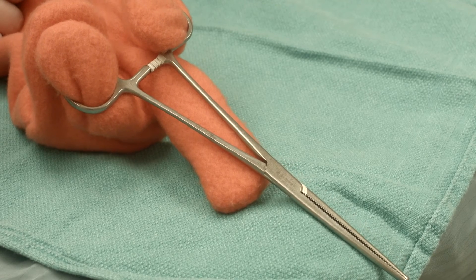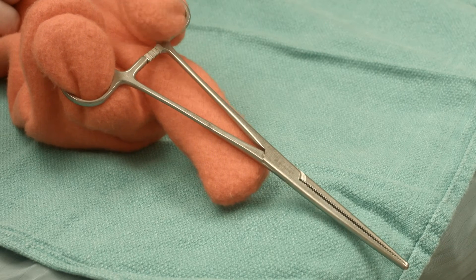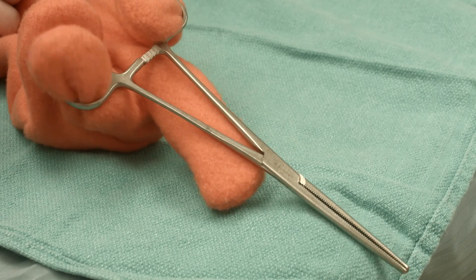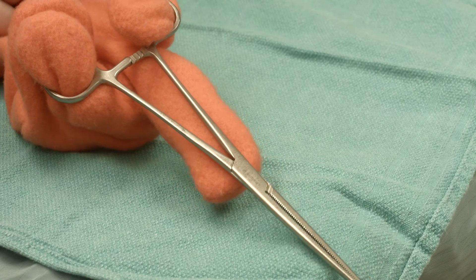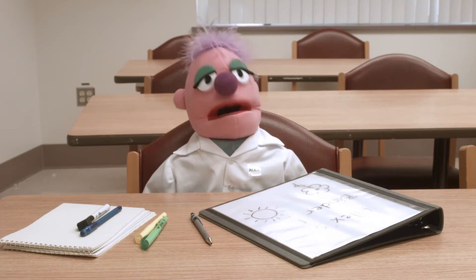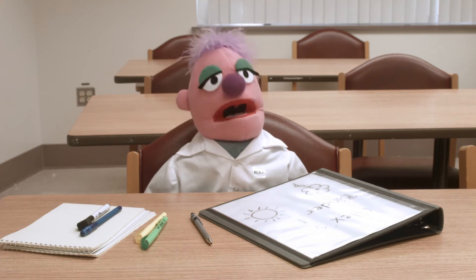How do you hold a clamp? Hold your clamp the same way you would hold a pair of scissors or tissue forceps. Put your thumb in one hole and your ring finger in the other. Use your index finger to steady the instrument, and you're good to go. So we just clamp the vessels off and cut them — it doesn't look that hard.